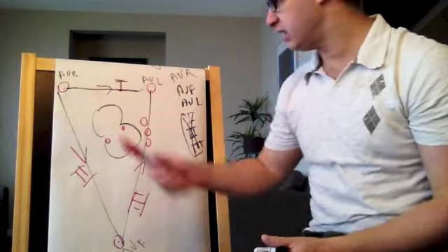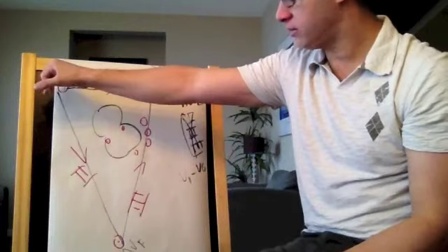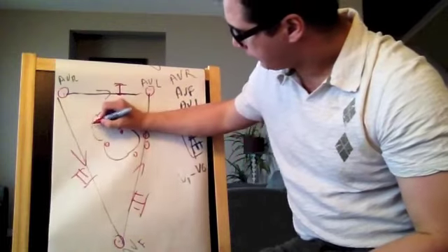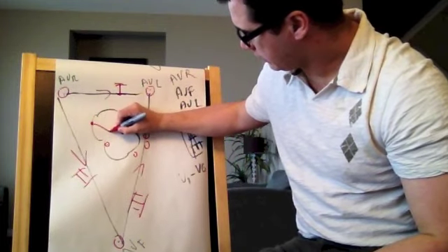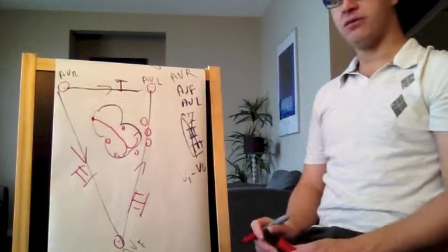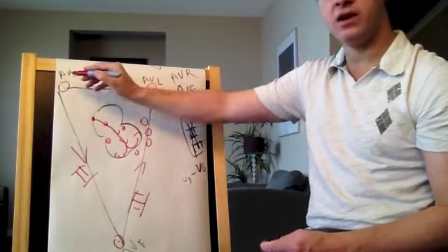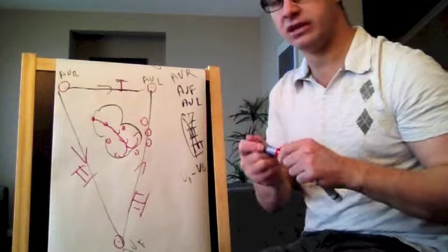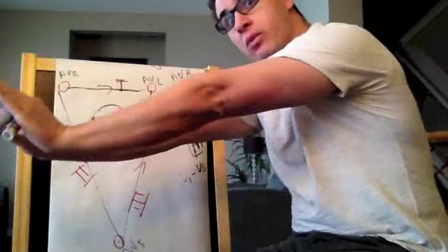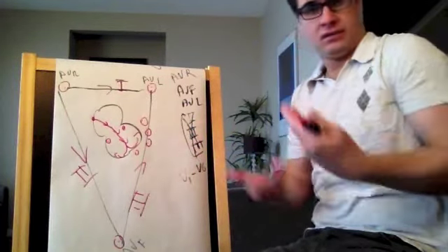And that's why, again, if you look at AVR, everything is negative. Why? Look where it is. Look where the electricity is going. Don't forget that electricity right now is going like this, that way, right? So the electricity is going this way. Well, AVR is there. So that means, again, rule number 2, and that's why it's so important to understand that one, and it's so easy as well. Because electricity is going away, everything will be negative. Everything coming towards me will be positive.